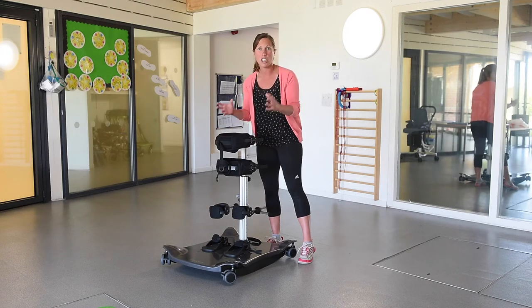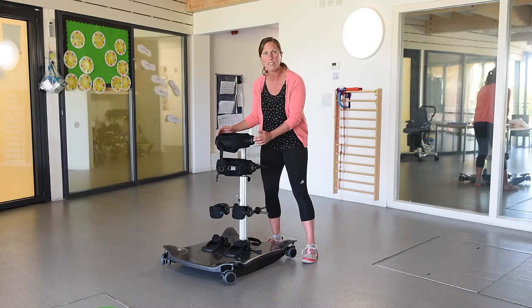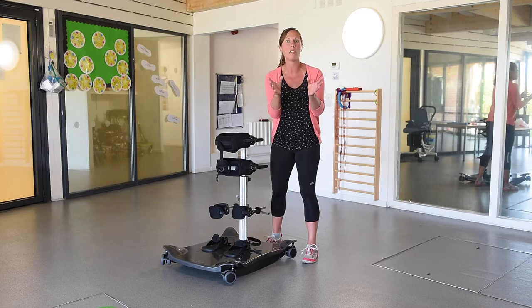Using this ratchet system you can get a nice firm support first and then de-rotate using that ratchet system to square up the trunk and the hips, so you get that nice alignment hands-free. It's doing the therapy that your hands would normally be doing.